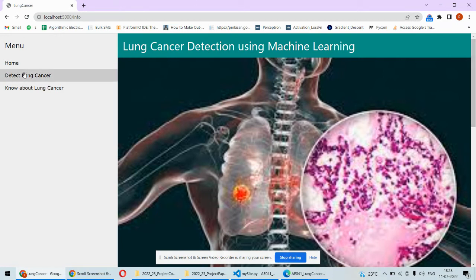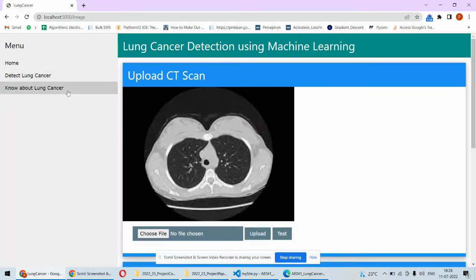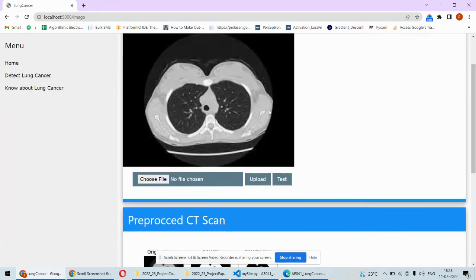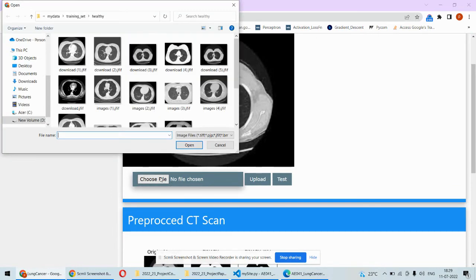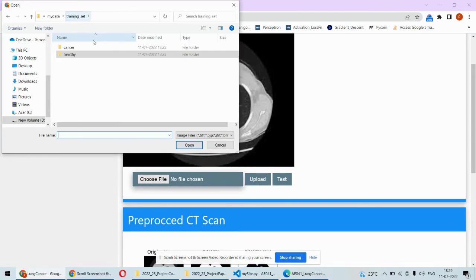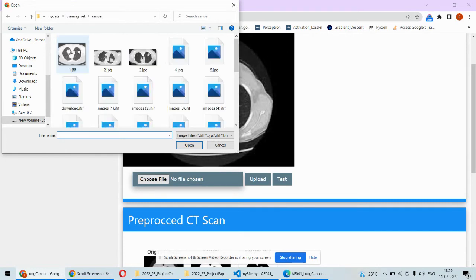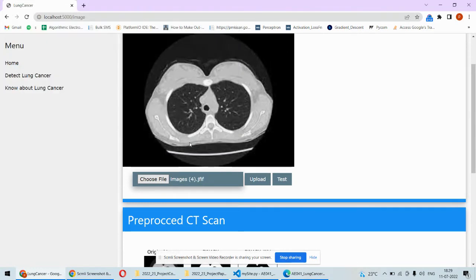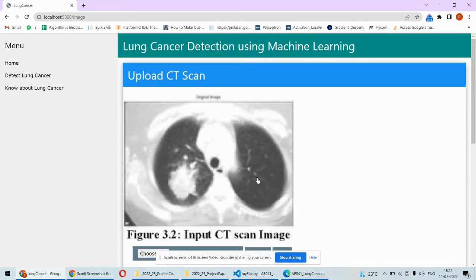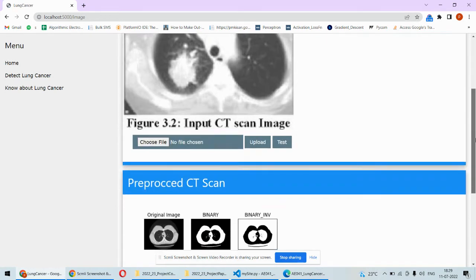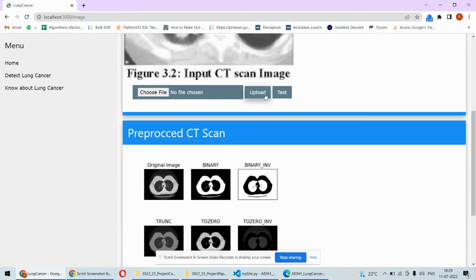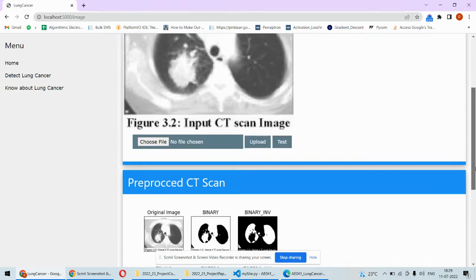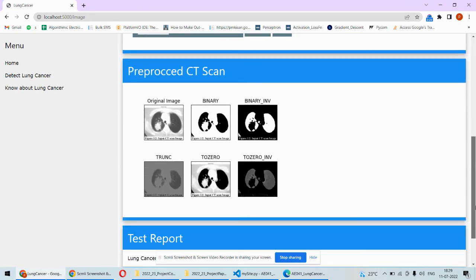Whenever we click on Detect Lung Cancer, this is the main page where you will have to upload the CT scan. For example, we are having the cancerous as well as the normal ones, so we pick this one and then we upload. That image will appear over here and then once I click on test, for this image the processing will happen.